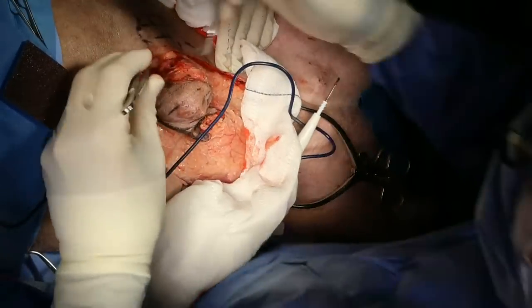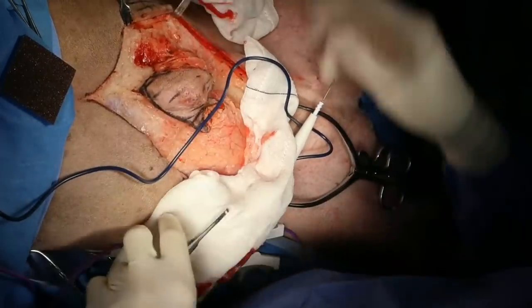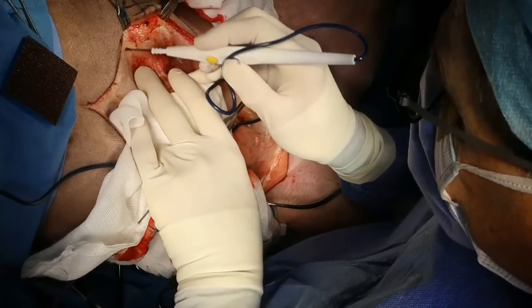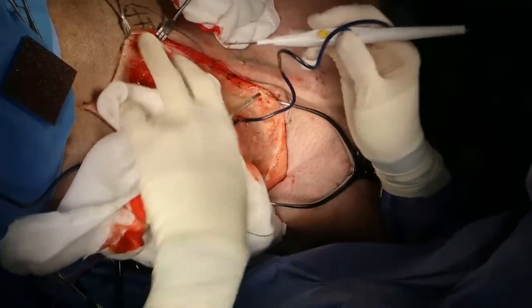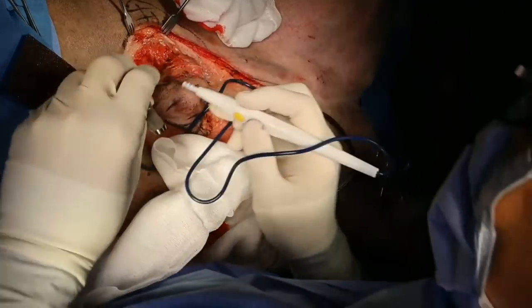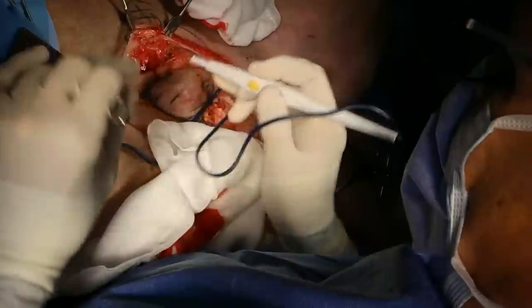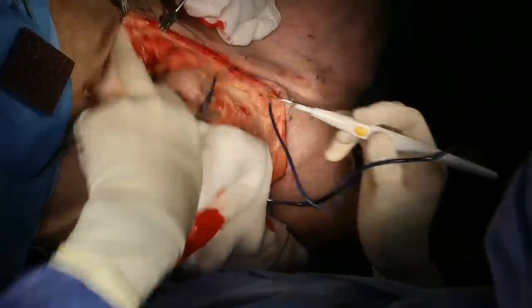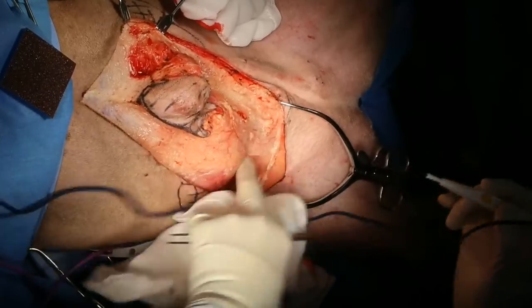Senn retractors. Relax on that for a second so I can feel tumor all the way out to there. And tumor out to there. Out to there.